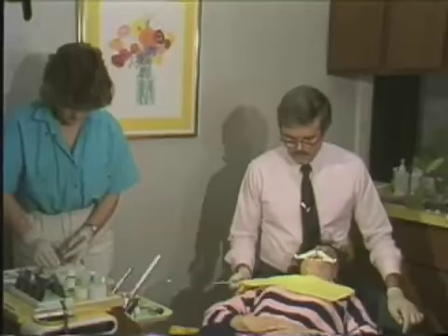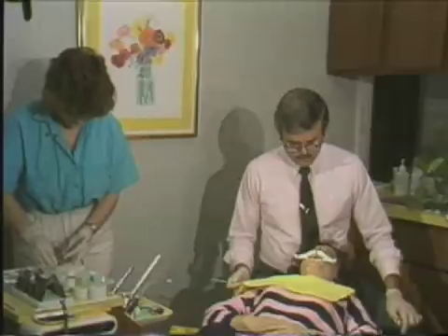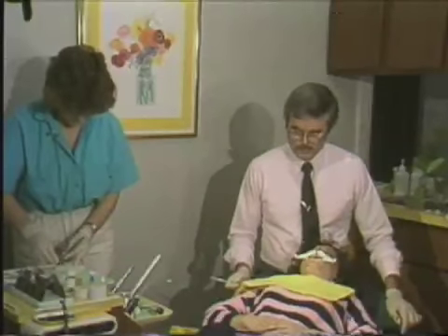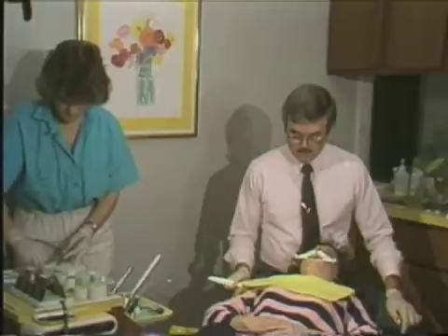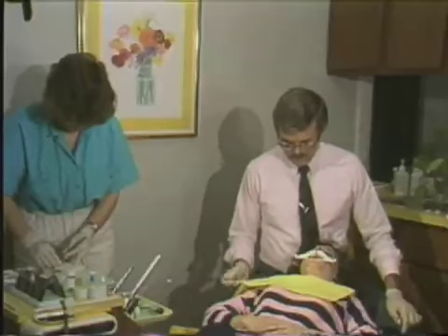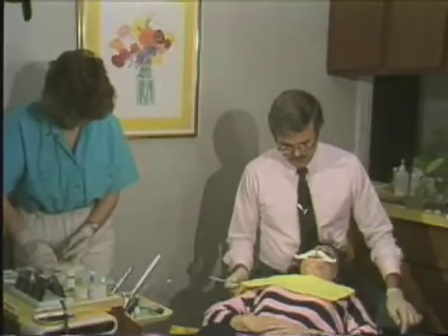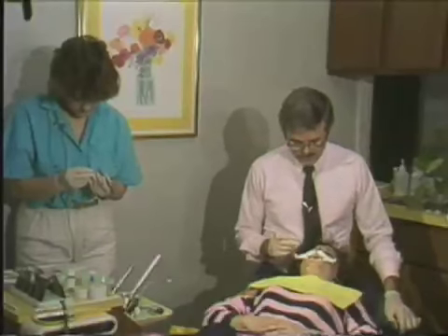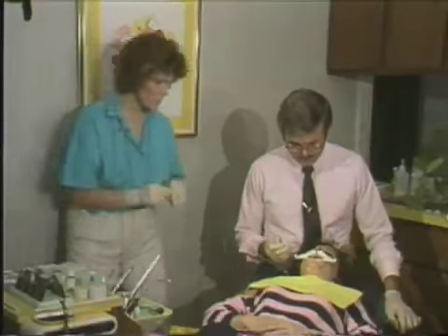Now, one of the things that is different about using a mixed product such as Phase 2 in contrast to Reliabond is the fact that there is no primer placed on the bracket itself. It is strictly the A and B paste, which acts as the catalyst and the base. We are now going to place the bracket on the lateral incisor.